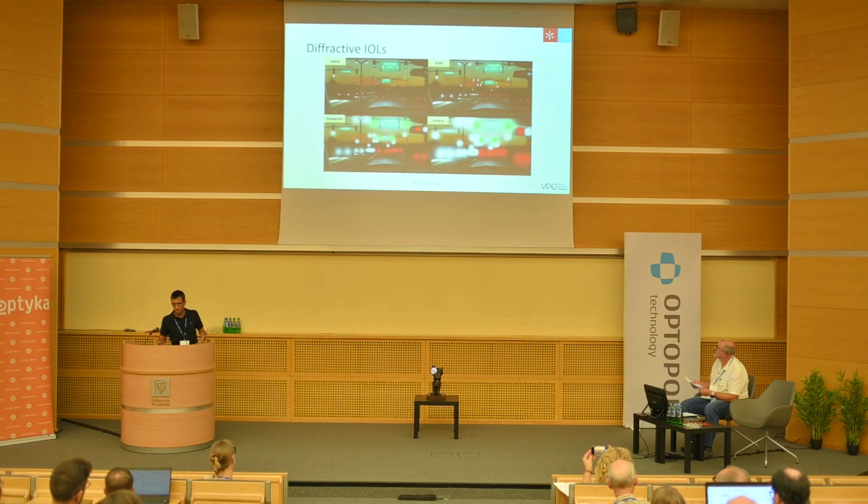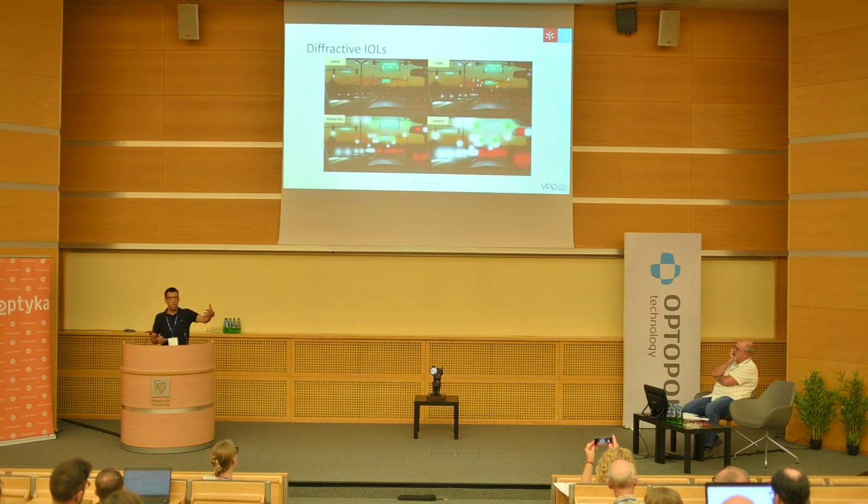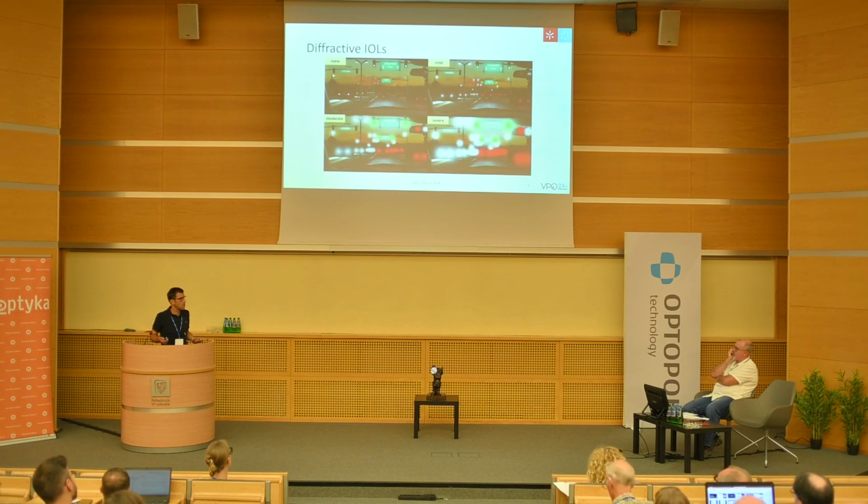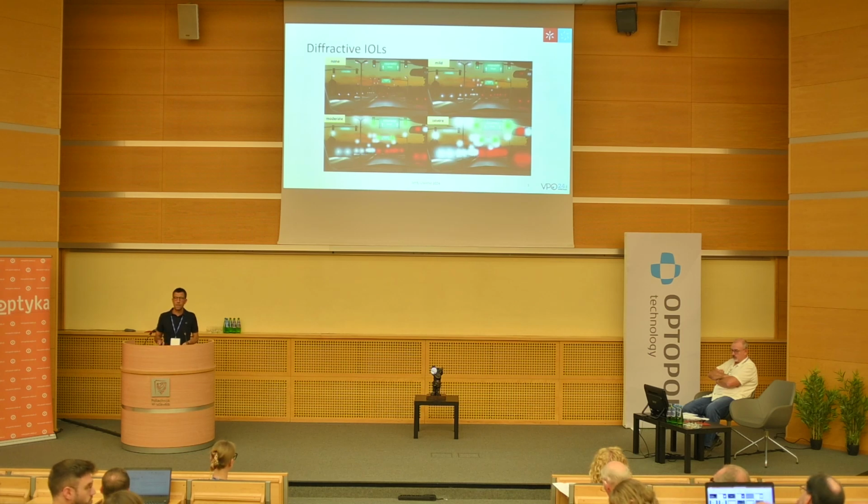Normally they occur at nighttime when the background is black, so the light that forms around bright light sources gets intensified by the dark background. Depending on the patient and the IOL model, this can be mild to quite severe.